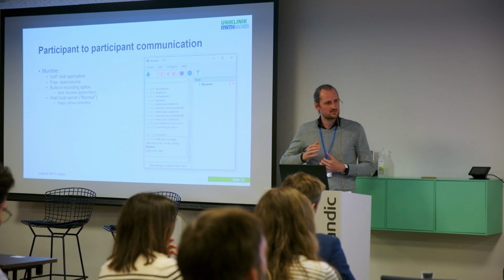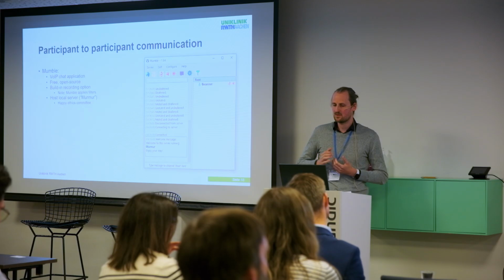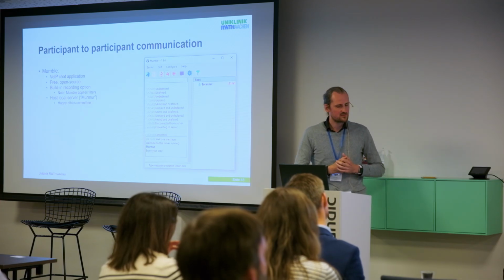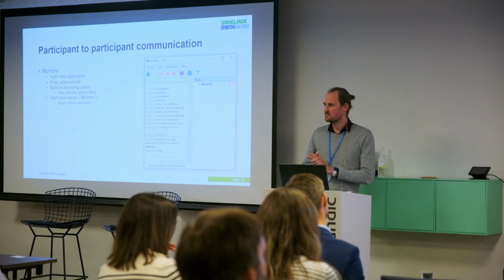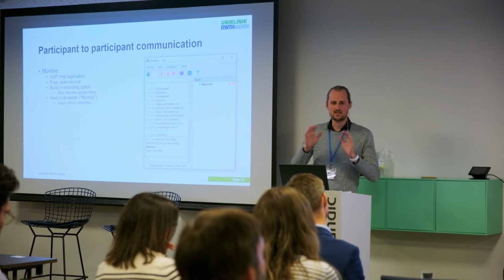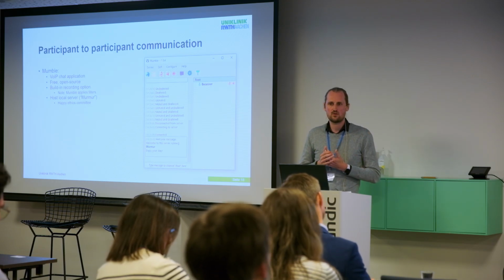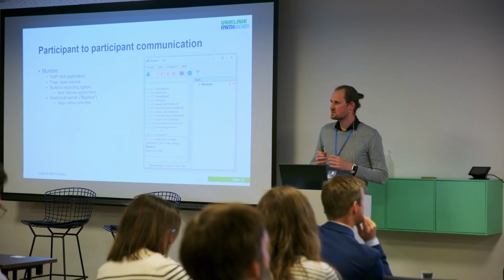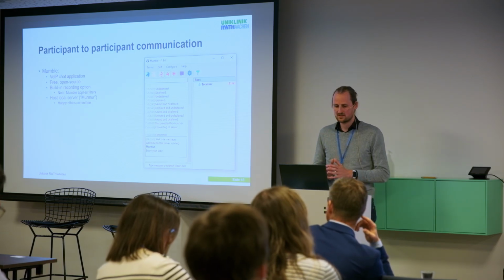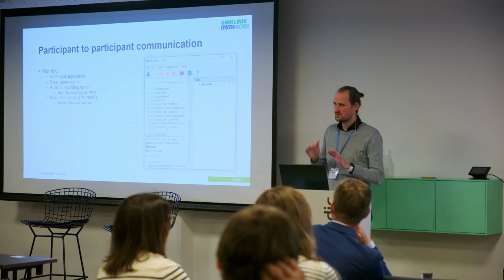How we did this was with something, again, quite basic. Mumble, in our case, it's a voice-over-IP chat application. Again, we like free and open source software. We specifically like Mumble because it comes with a built-in recording option. It's not a great recording option because it's a voice chat program. It has some filtering options. If you want to do advanced voice analysis, it might not be ideal, but in our case, we just wanted to record what the participants said, so that was fine. Most of all, it allows us to host a local server within the hospital, which made our ethics committee very happy, since transferring the communication outside the hospital was ethically questionable.